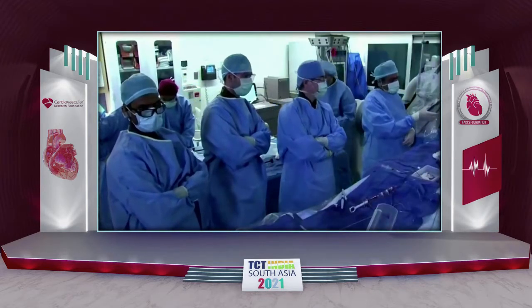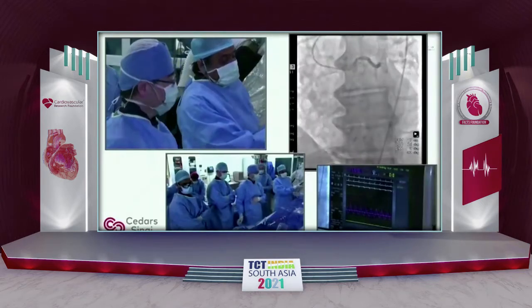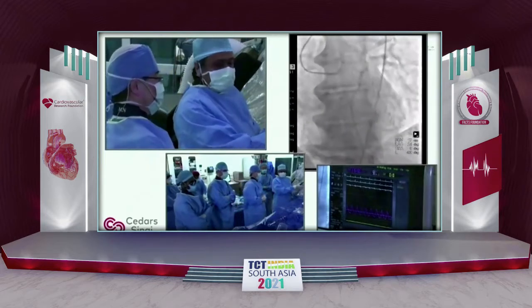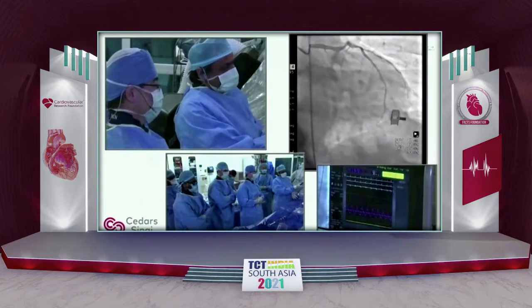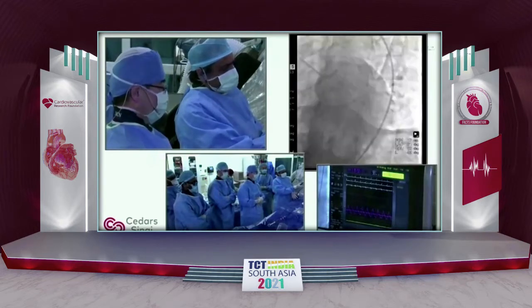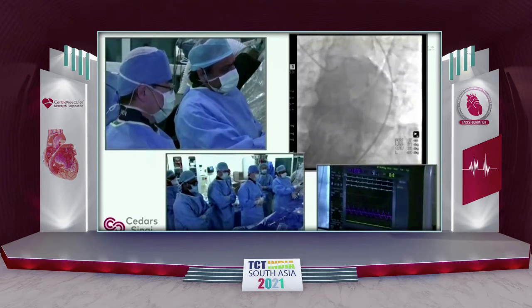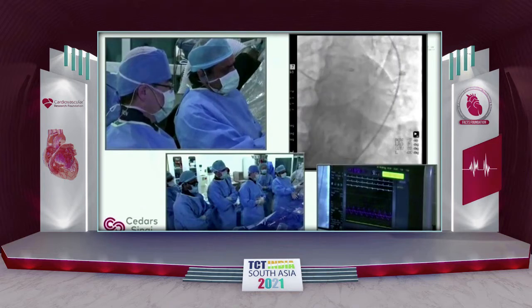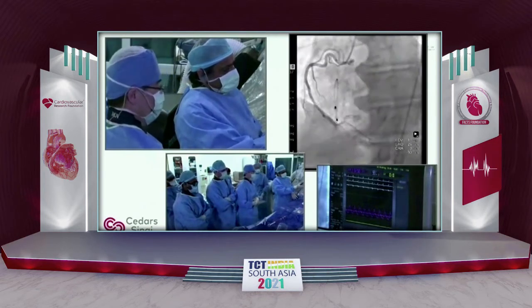So the coronaries are actually pretty okay here, and we don't do coronary angiograms now before TAVR. Most of the time we do it at the time of the TAVR procedure. The left main is pretty short here. It's almost like a separate ostium, but you can see some calcium in the aortic valve as well, which was nicely shown in one of the other views. This is the right coronary artery.